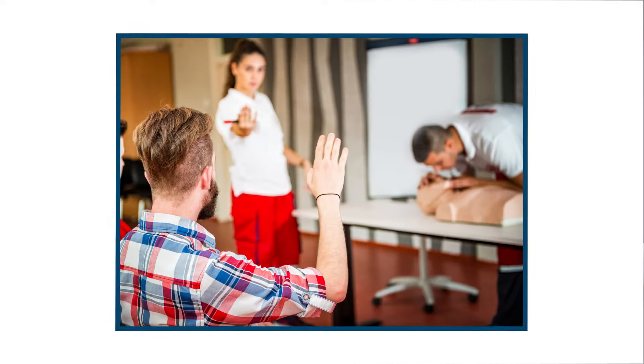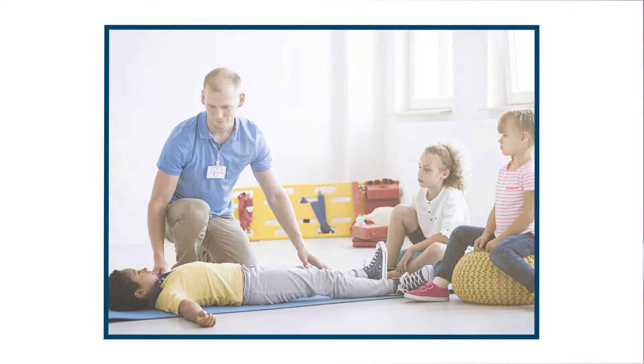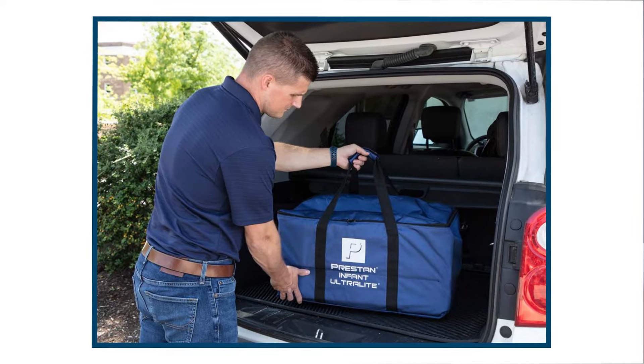Training environments can vary from large training centers, hospital-based classrooms, schools and businesses, or even virtual learning. Being able to adapt to each of these settings with equipment is important.